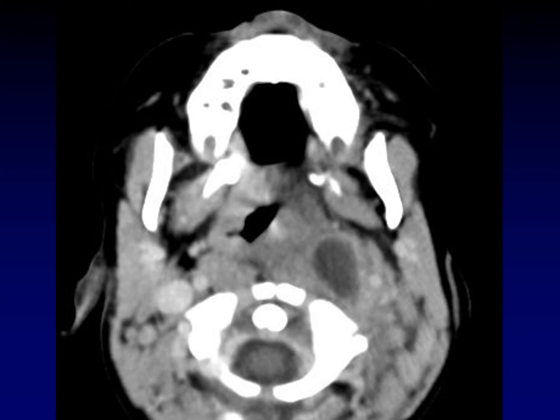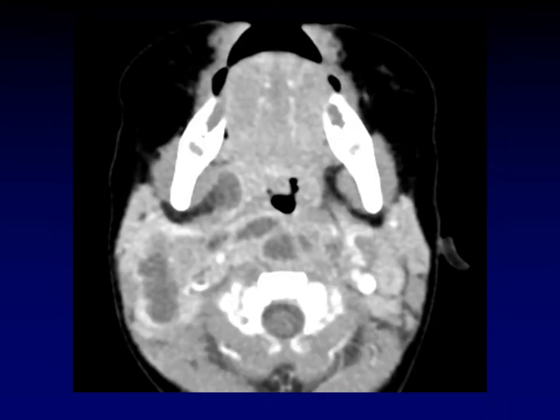Sometimes lymph nodes get overwhelmed by infection and form an abscess — this is called suppurative adenitis or suppurative adenopathy, seen almost exclusively in children. Here is a low-density mass with rim enhancement right where we'd expect a retropharyngeal lymph node, elevating the parapharyngeal fat predominantly anteriorly and a little bit laterally. If the infection escapes the lymph nodes and starts spreading through the retropharyngeal space, we get a retropharyngeal abscess, displacing the parapharyngeal fat predominantly anteriorly.